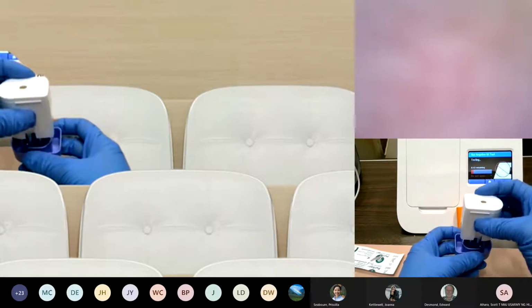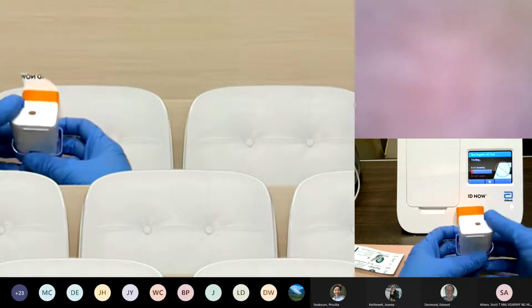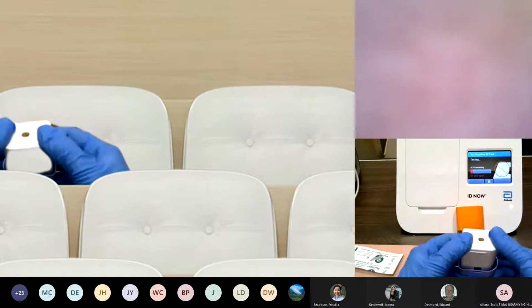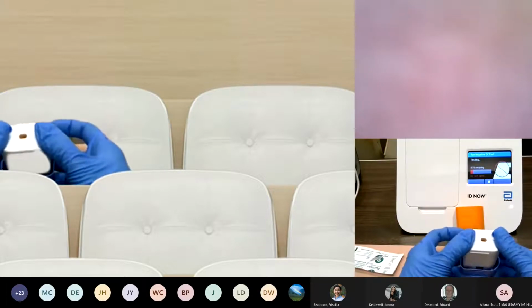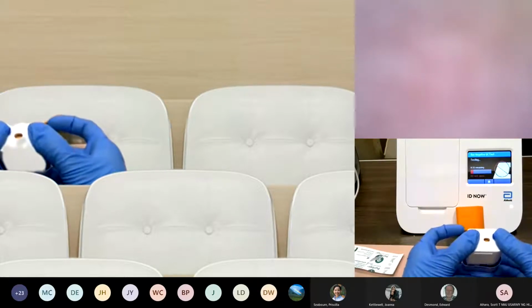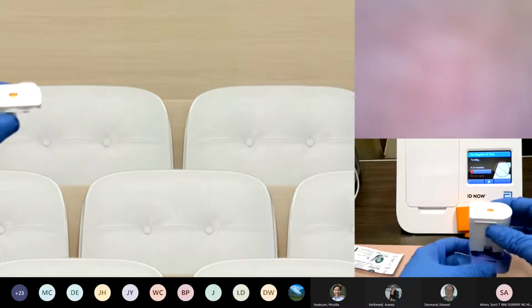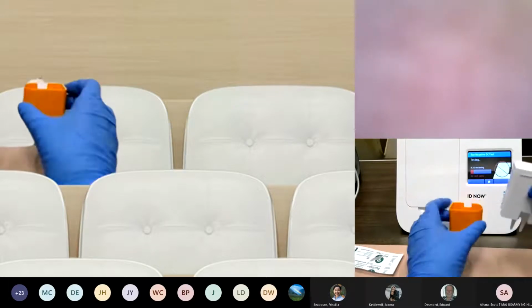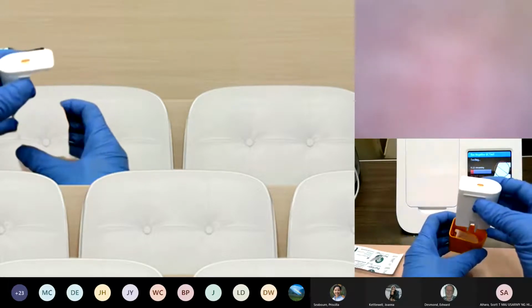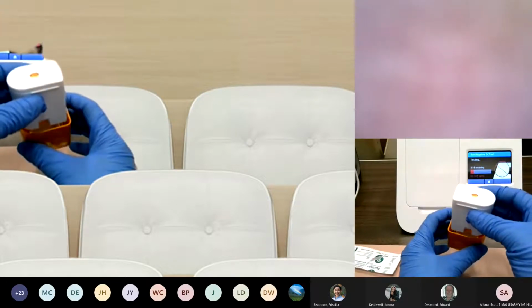This first part, everyone seems to do this correctly, which is great because some people just rely on the clicks, which again, I said, don't do that. But let's see. Okay, so you see that indicator lift up. Though people do that portion correctly, this is the part that people seem to make errors in. And I'll show you why.